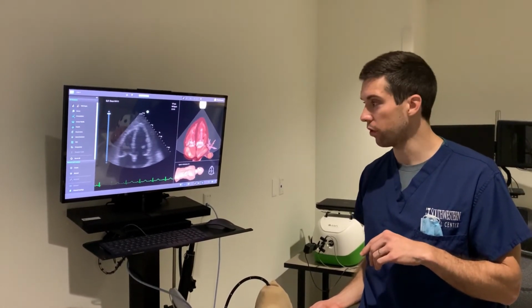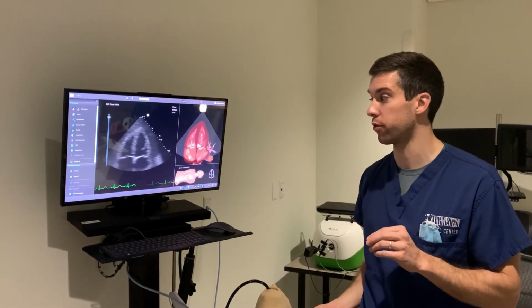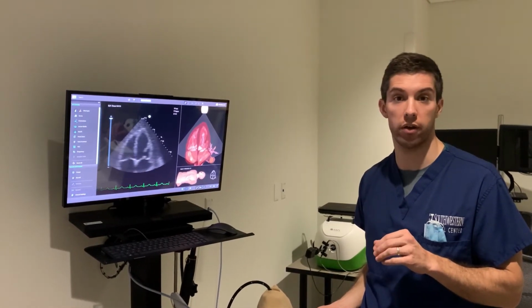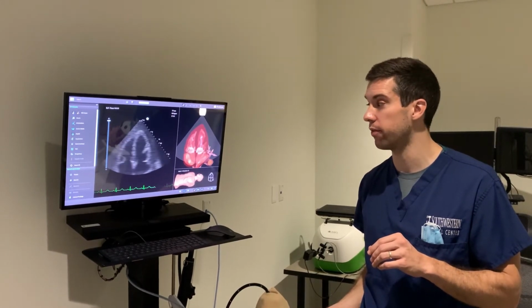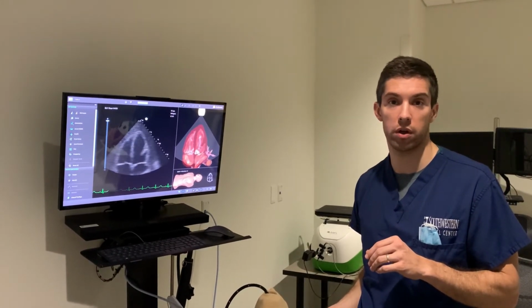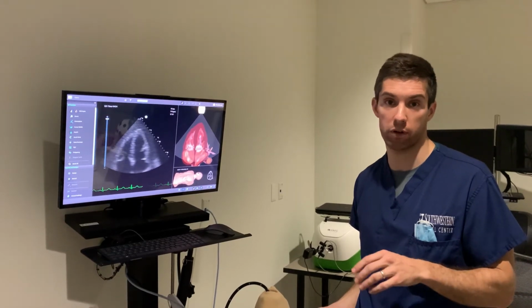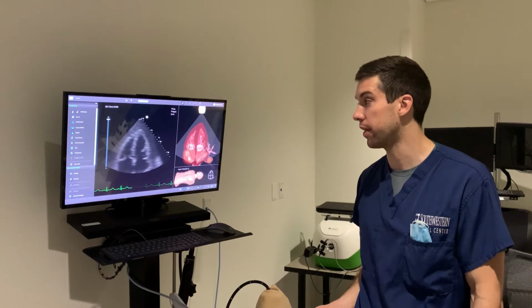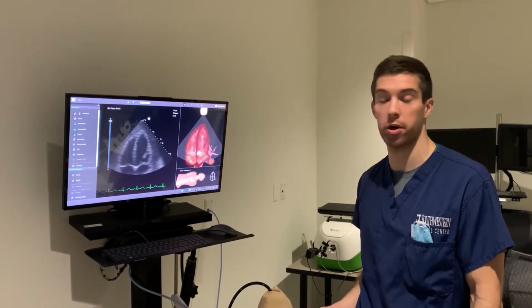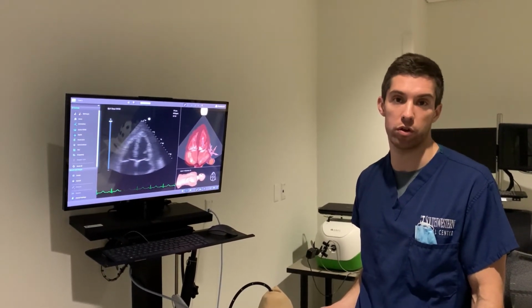When we eyeball it, the right ventricle should be about 2/3 the size of the left ventricle or smaller. If it's the same size as the left ventricle, it's probably enlarged. You can actually measure the right ventricle during various phases, but we're not going to get into that during this video. And then three, looking for pericardial effusions is again a good thing to do from this view.